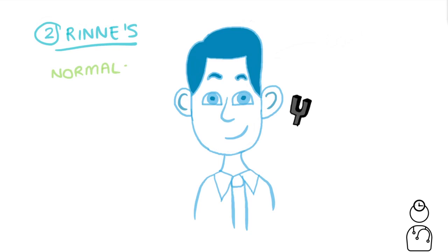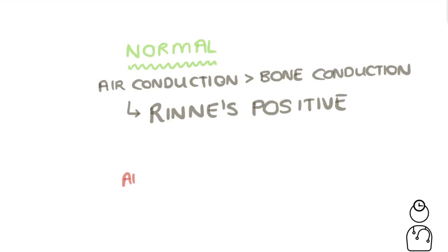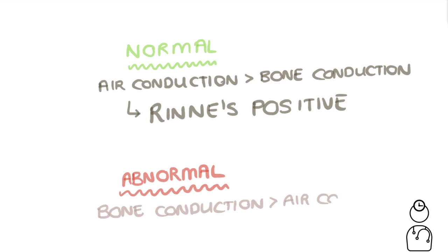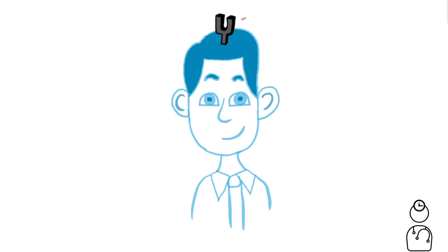In a normal situation, Bob will say that the sound was louder when the tuning fork was next to his ear than when it was on the mastoid process. Rinne's terminology is a bit different. A normal test, i.e. where air conduction is louder than bone conduction, is known as a Rinne's positive test. An abnormal test, on the other hand, where bone conduction is louder than air conduction, is known as a Rinne's negative test. So let's put the two together.